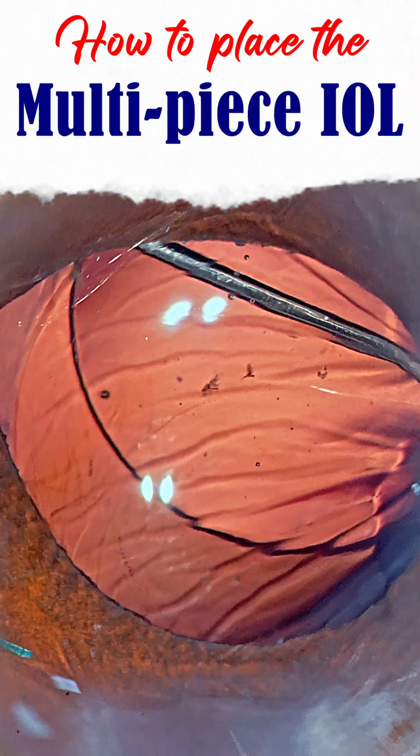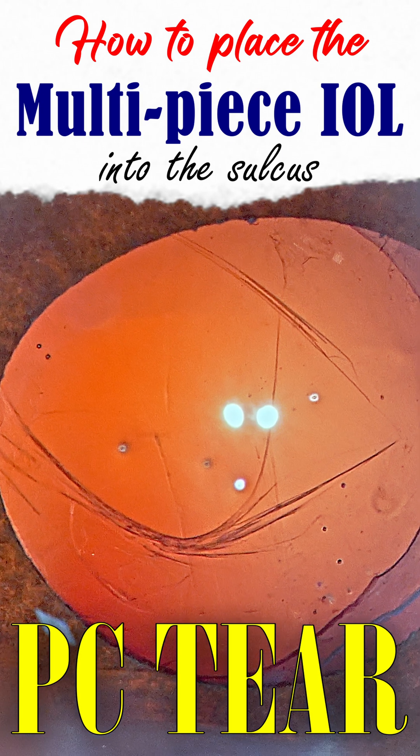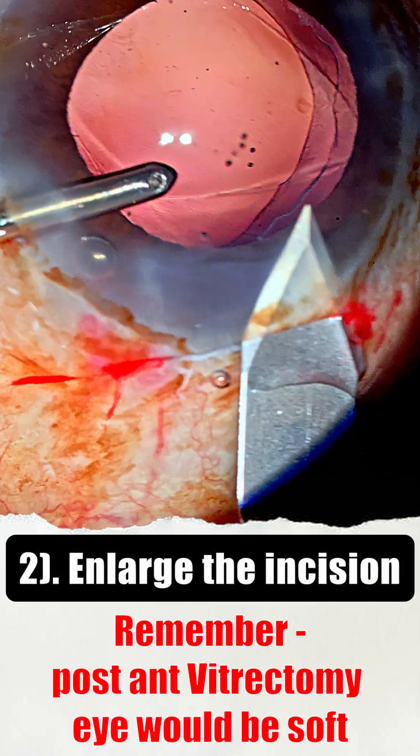How do we place a multi-piece intraocular lens into the sulcus when we have a large posterior capsule tear? Tip number one: always ensure that you've done a thorough anterior vitrectomy. Number two: enlarge the incision just a little bit.